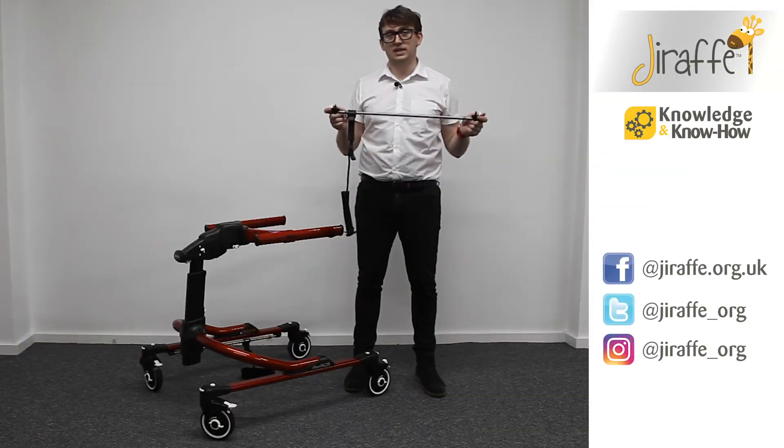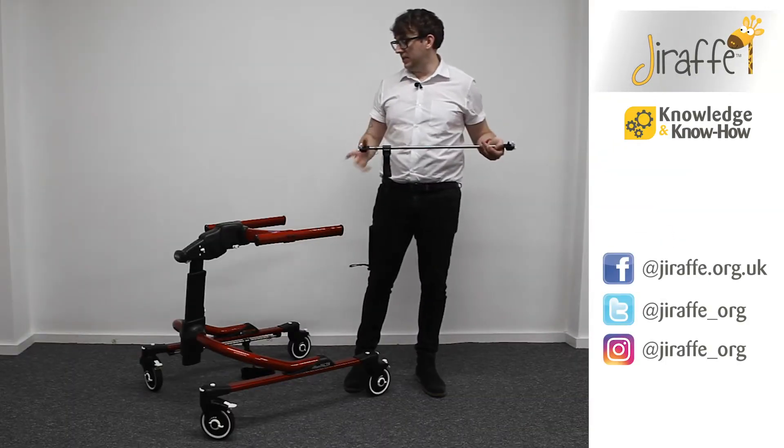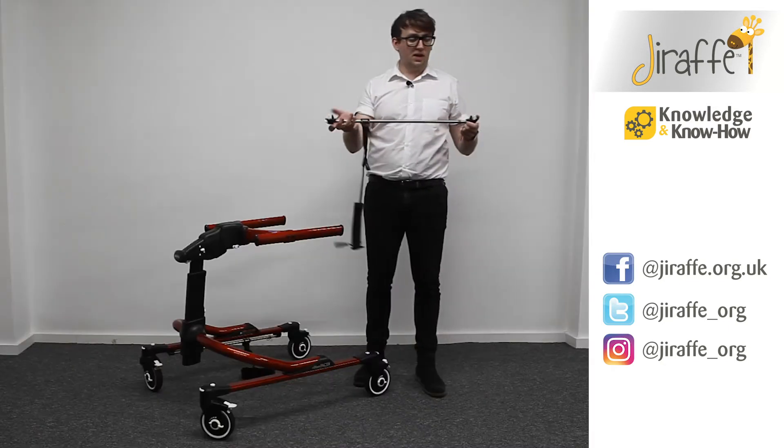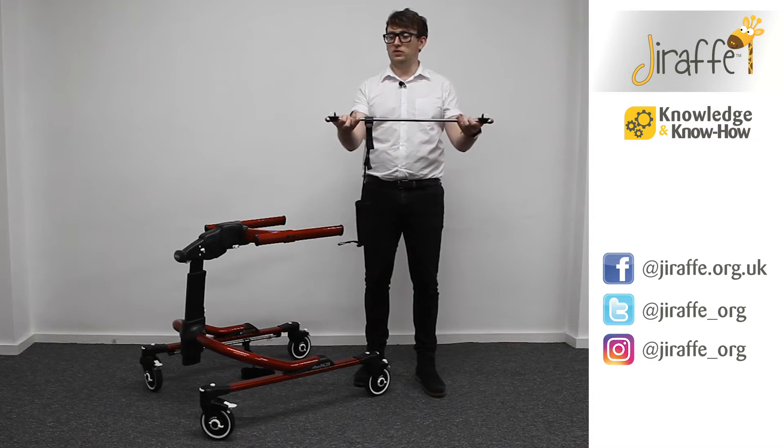We're now going to take a look at the Riften ankle prompts. As you can see, we've already attached the right-hand side ankle prompt on the bar itself. We've got two white buttons — if we press them in, you can see that activates the locking mechanism.